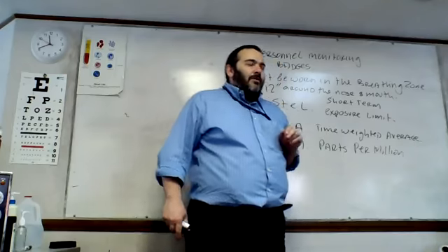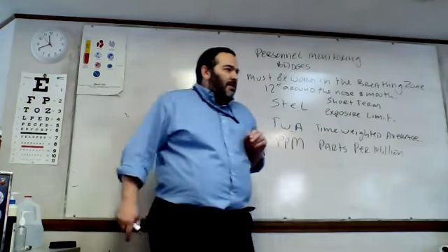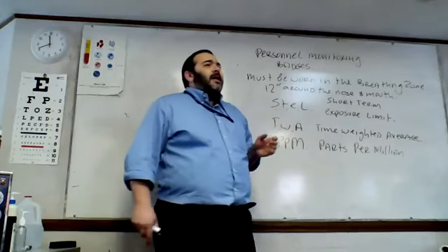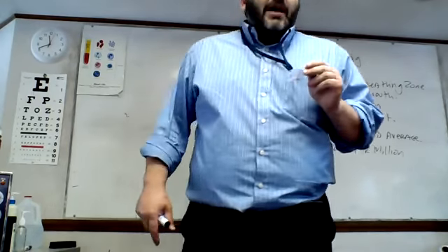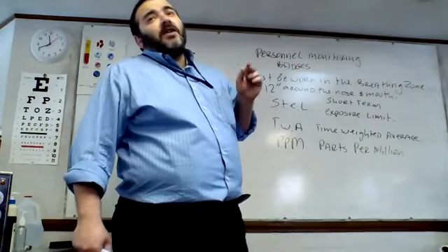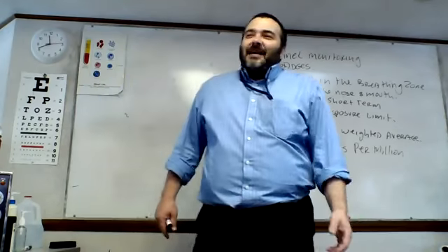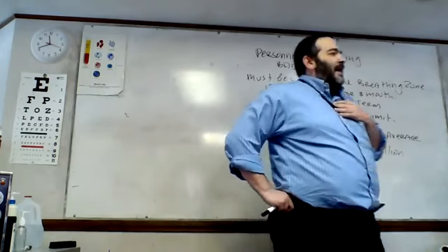Ozone, I believe, is 0.1. So is H2O2, if I remember correctly. It's 1.0. Okay. You need to remember that for the exam. So you need to know the time-weighted average in ppm for the exam. Oh, it rhymed. Did you hear that? Okay? Does this make sense?